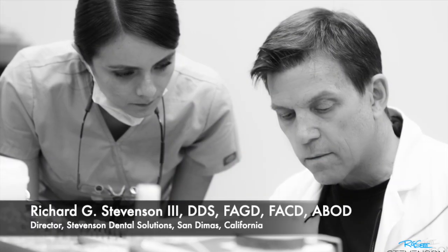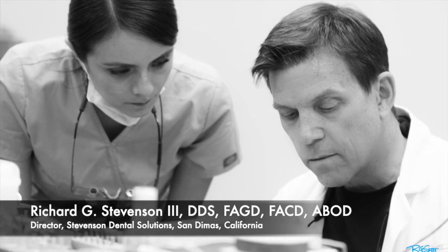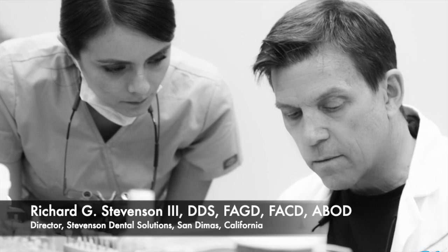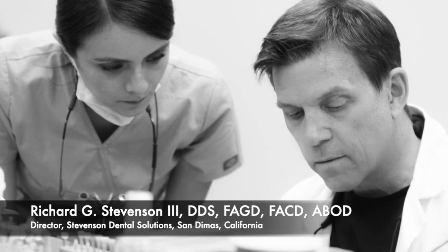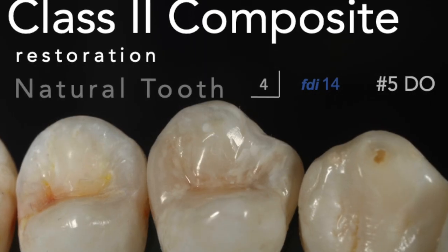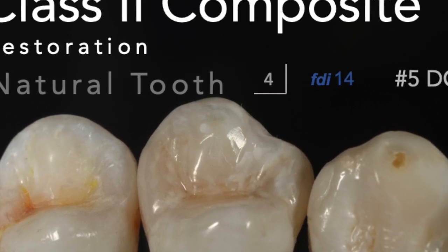Hi everybody, I'm Dr. Richard Stevenson and I'm the director of Stevenson Dental Solutions in San Dimas, California. Our center is dedicated to excellence in teaching and expanding your knowledge and skills, and one of the toughest things we encounter as dentists is the class two composite, so I thought I'd make a short video on how to perform this particular procedure.